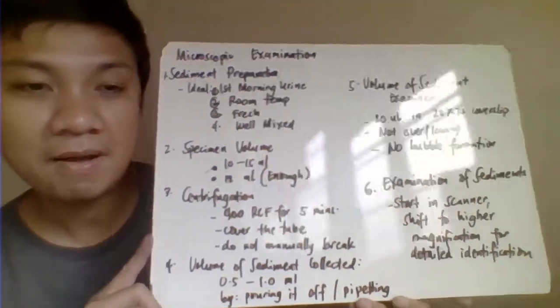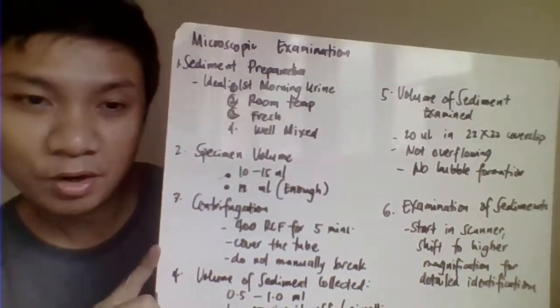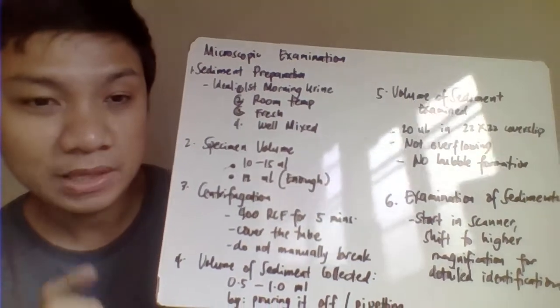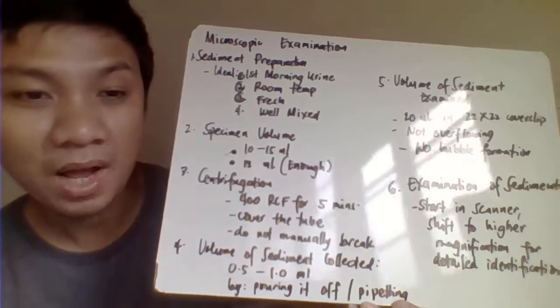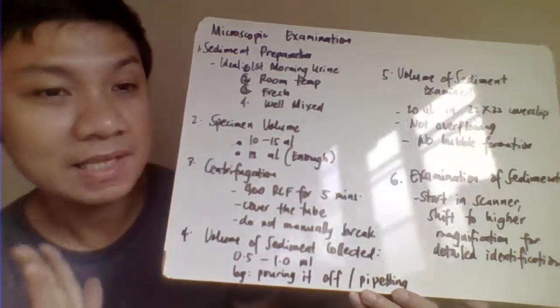Okay, then we have here the microscopic examination of our urine sediments. So microscopic examination of our urine sediments is the last phase in the entire routine urinalysis procedure. This is a way of confirming what's really causing the atypical findings in the physical exam.